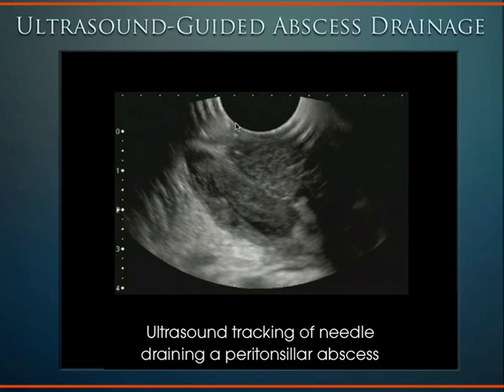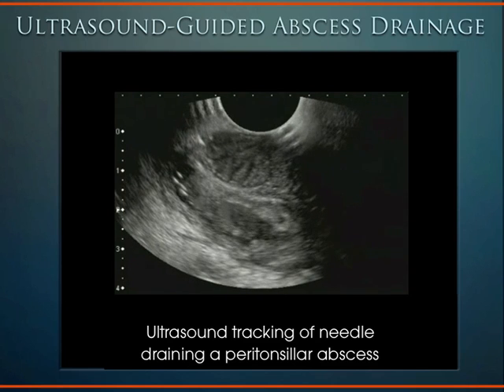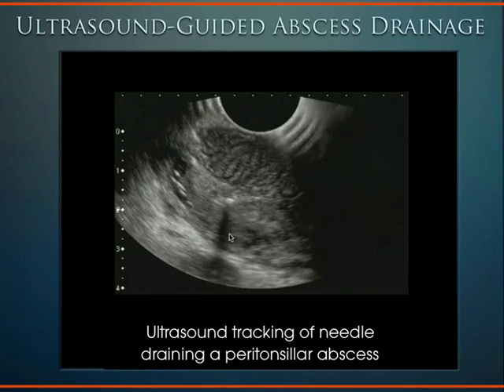But we went for this one ourselves. You're going to see here a needle coming into this abscess, and that's the ultrasound guided. We can see the needle has made its way. Actually, you can see the distension of the tissue down here, that needle tracking into the abscess.